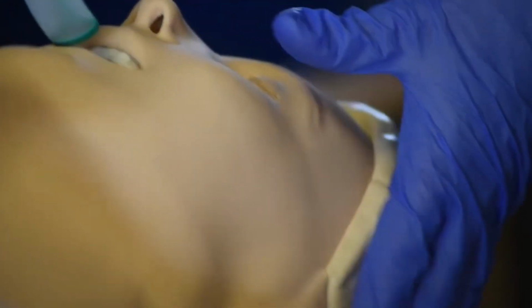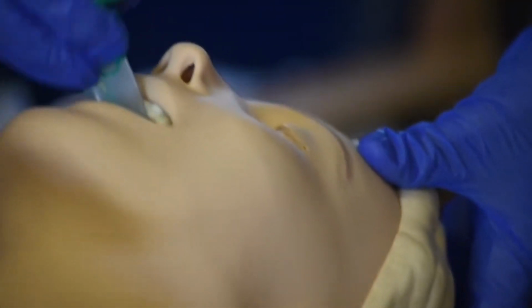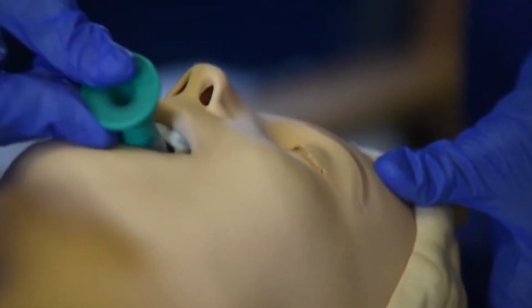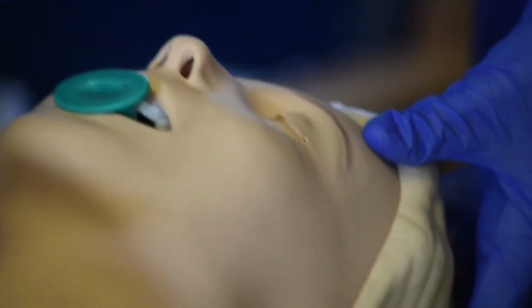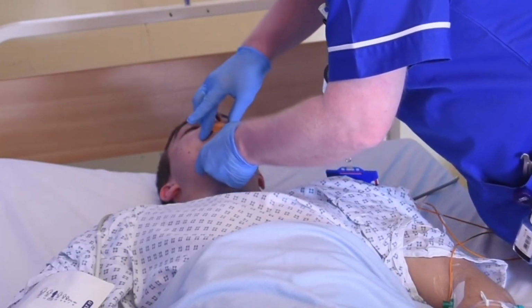With a head tilt chin lift employed, the correctly sized OPA is introduced with the curve pointing towards the patient's head and inserted along the hard palate until resistance is felt. At this point, the airway is rotated 180 degrees until it slides over the back of the tongue. The head tilt chin lift can then be relaxed and the patency of the airway assessed. The OPA is well tolerated by the unconscious patient.